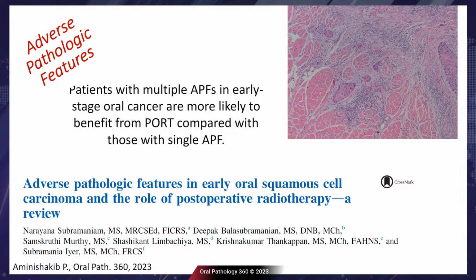It is very important to determine the adverse pathologic features because most investigators believe that patients with multiple adverse pathologic features in earlier stage oral cancer are more likely to benefit from post-operative radiotherapy compared with those with a single adverse pathologic feature. And you can see in the photomicrograph in this slide tumoral nests extending to adjacent striated muscular bundles, which is a significant adverse pathologic feature.